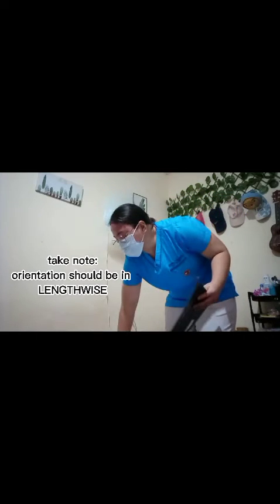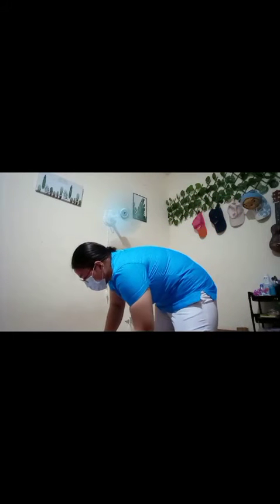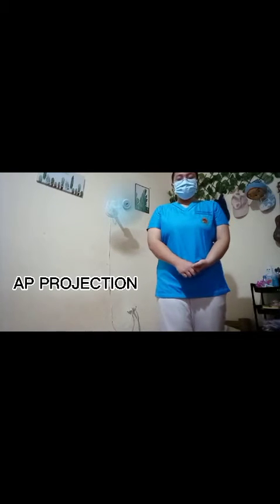Sige. Thank you. So, for our procedure this afternoon, we are going to conduct a AP projection of the femur. So, for the femur, we are going to use 14 by 17 inches of IR size, which will be put in the table, nakaset. So, it will be located here, assuming that this is a radiographic table. So, the first procedure will be AP projection of the femur. Ma'am, proceed lang tayo, ma'am.